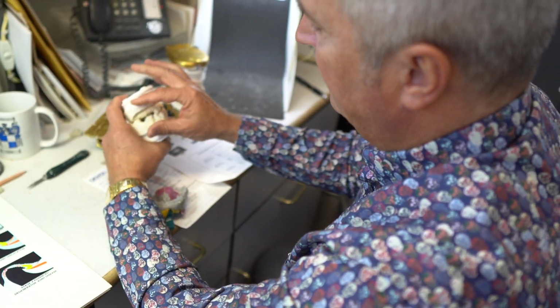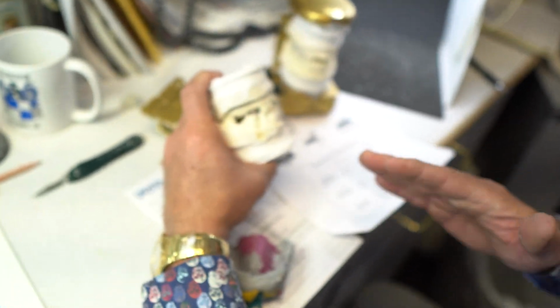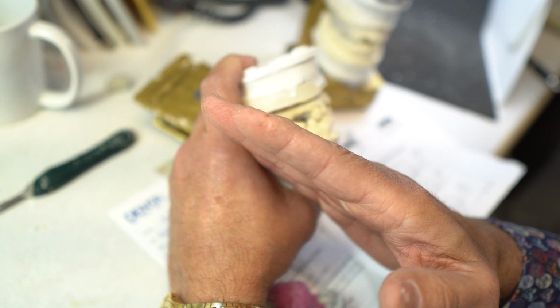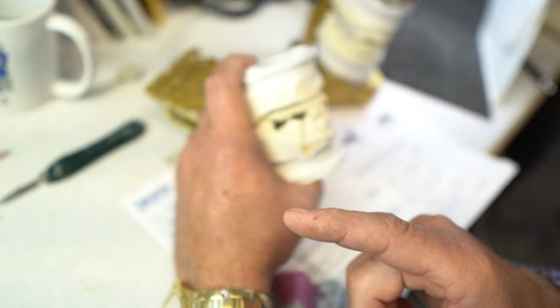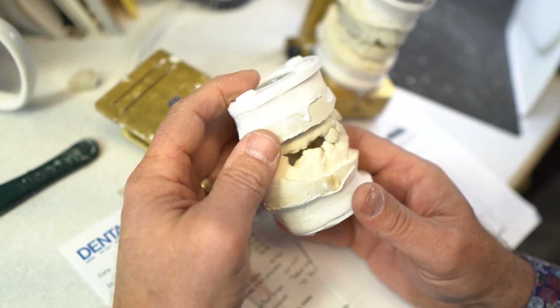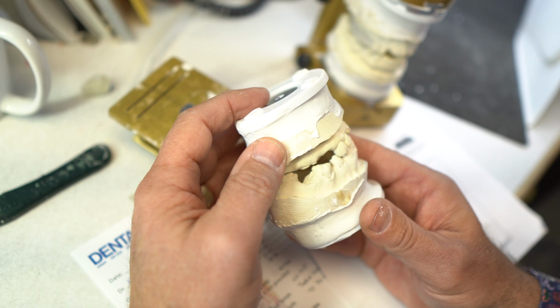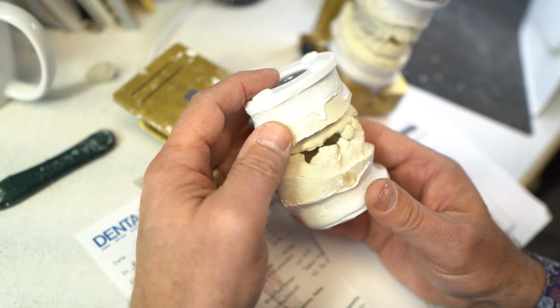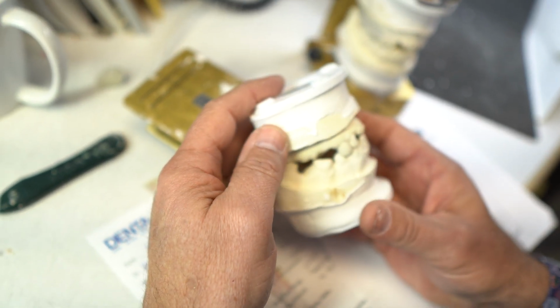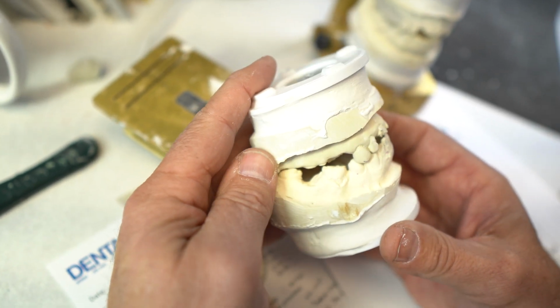But anytime dentition is, or this vertical is that closed, that condyle only has one place to go, and that's upward most, backward most. So for us to just open this on a hinge articulator is absolutely crazy. We just would never do that. It's not going to give the patient the results they're looking for.